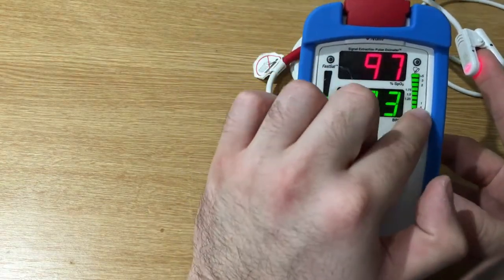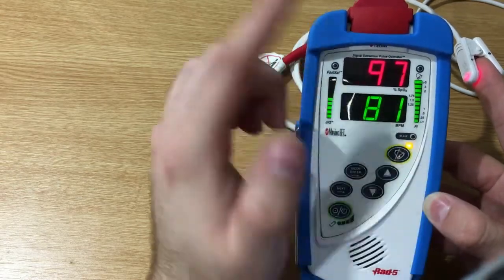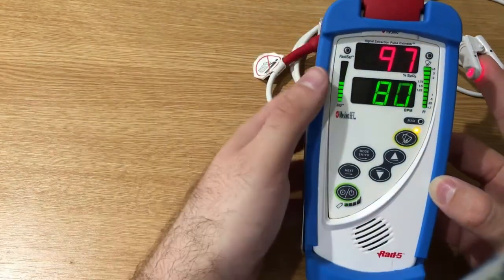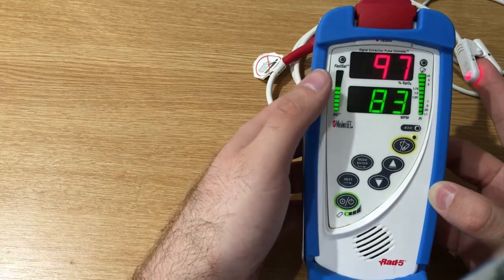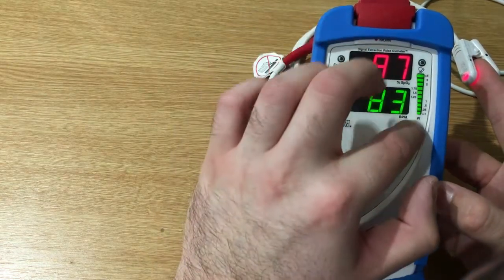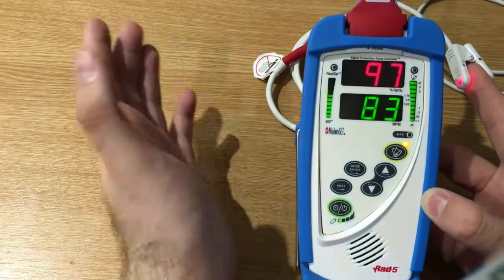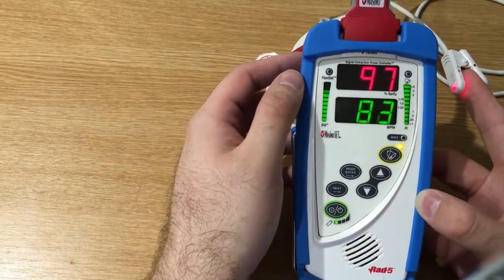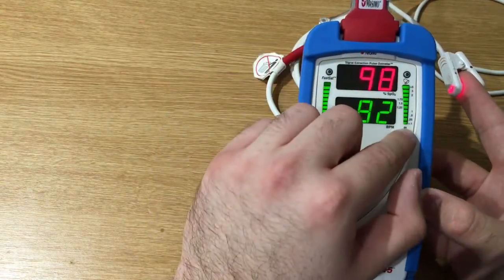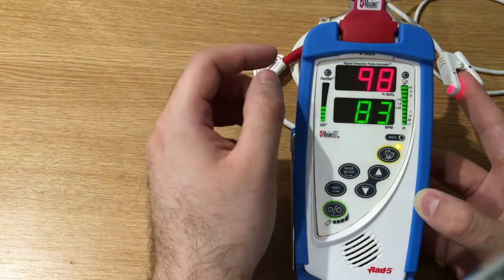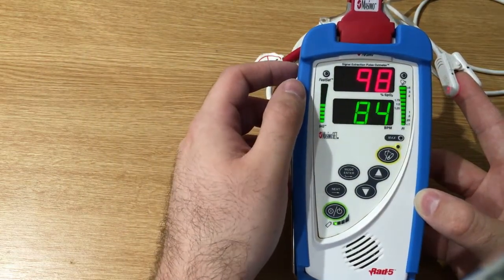So this doesn't have the PVI as the Radical 7 has. It has just the pulse index, and the pulse index is the ratio between pulsatile to the non-pulsatile blood flow.